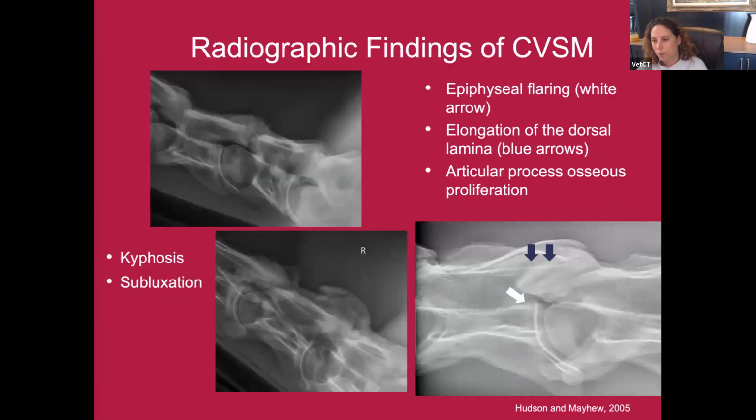So we draw off usually about 50 mils of CSF and inject at least that volume back in. The strength of contrast does matter. A couple of years ago, there was a contrast media shortage, and I know people ended up with different strengths. So I would suggest 300 or 350 mgs of iodine per mil. Double check the strength. And if you're doing all that, maybe hold up the neck a little longer. We do hold the head elevated for 5 minutes or even up to 10. If we are not seeing good flow of contrast, you can hold it up a little bit longer, and that can be helpful. And then finally, make sure you're getting good quality images of the caudal C-spine.